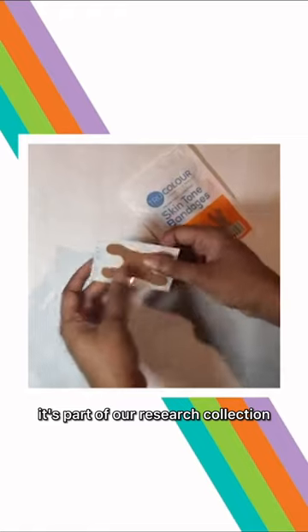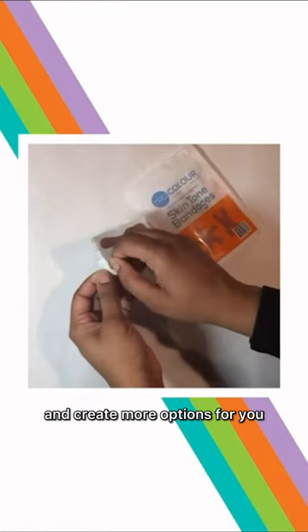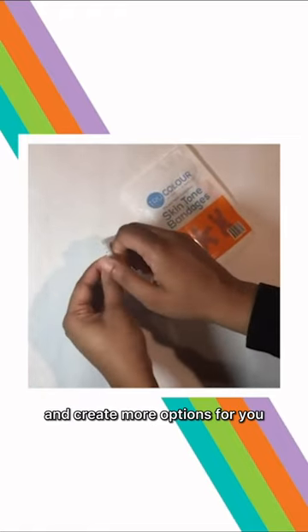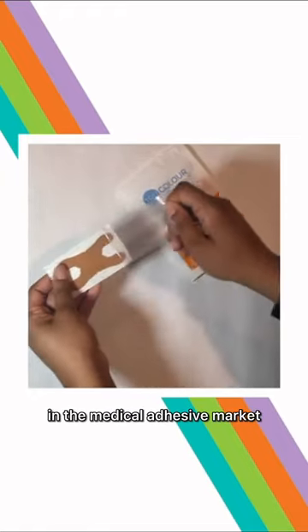It's part of our research collection. New products that we're exploring to innovate and create more options for you in the medical adhesive market.